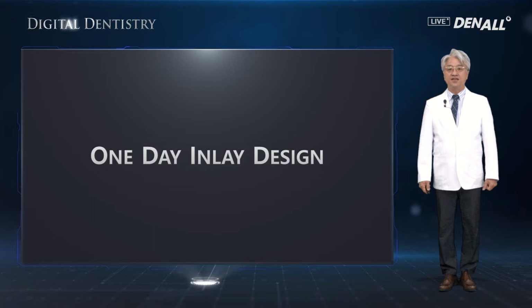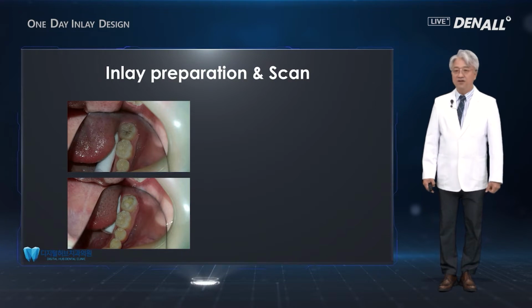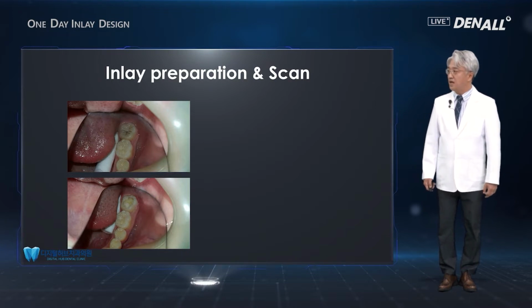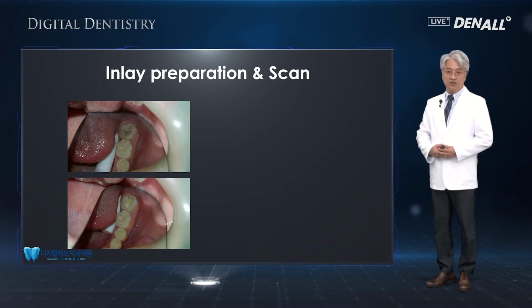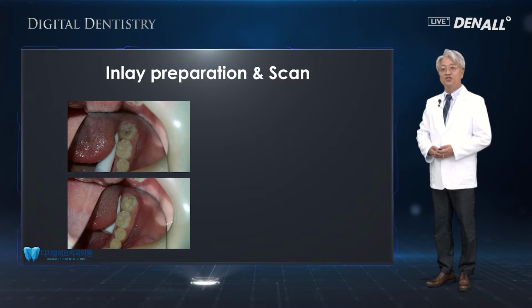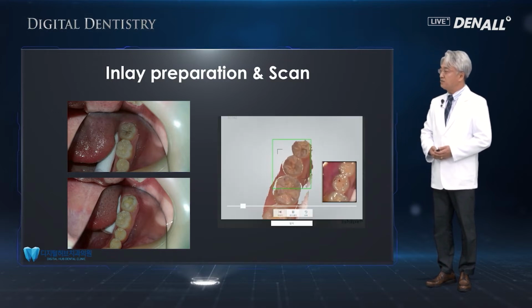Today, we are going to look at part 8 of this lecture series on the one-day inlay design. First, when it comes to inlay, this is a case where I did the one-day inlay. Due to caries on number 37, inlay treatment was planned, and as you can see, preparation was done, and then using the oral scanner, you can see the scanning is also done.